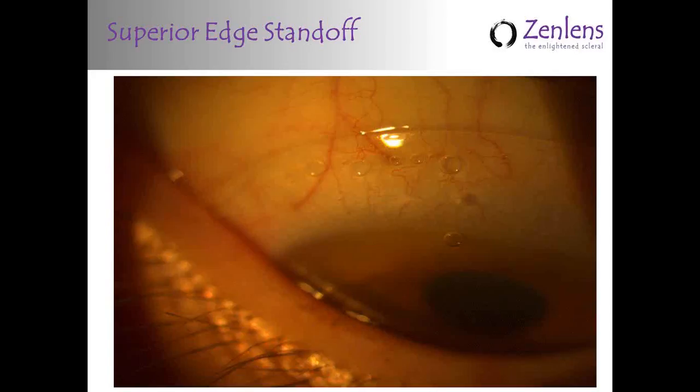Here's an example of one that's a little more obvious. This would be the type of thing you can see with white light. This is actually a bubble, a series of bubbles. If we had it in video, you'd actually see these bubbles moving underneath the edge of the lens and into the corneal chamber, where they would coalesce into creating a larger air bubble. So this was a rather obvious example where the edge is lifting off too far from the scleral, the conjunctival surface, and it's allowing air to get through. So you would need to steepen this.